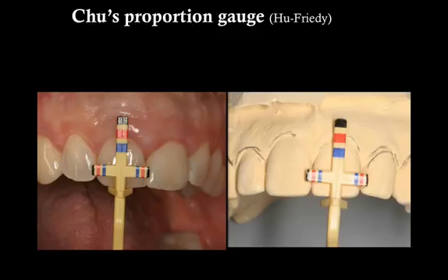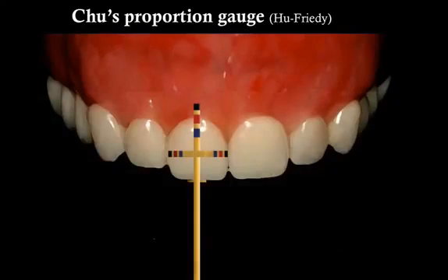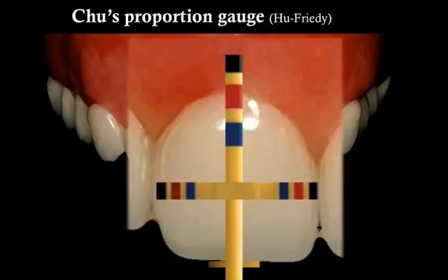So that's another nice, inexpensive tool that you can use during the surgery. It's very, very helpful to me. So I would have this available at the time of surgery. I would place it on the incisal edge and measure and see what is the width between which lines, and then I'll know how much to excise.